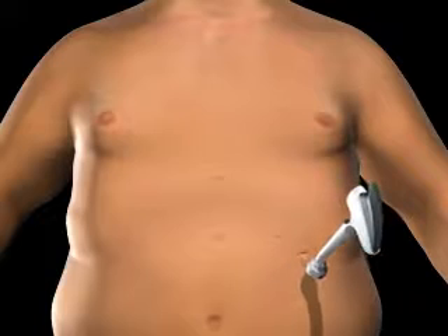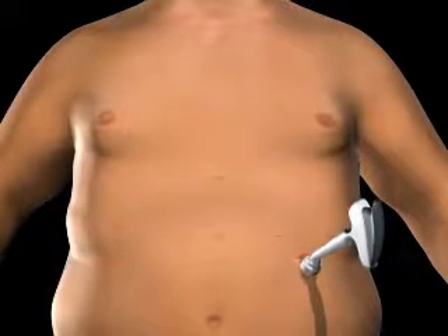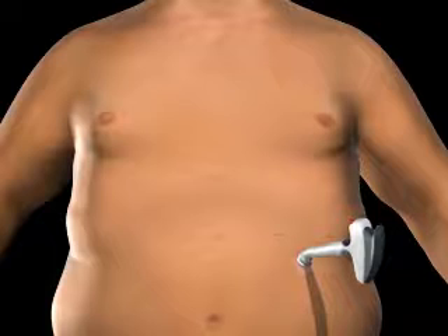The tube is secured using the locking connector on the port. The injection port and tube are placed beneath the skin.